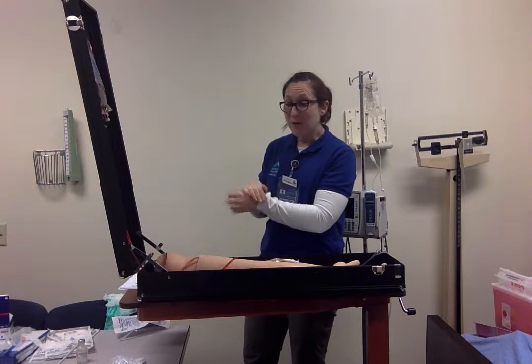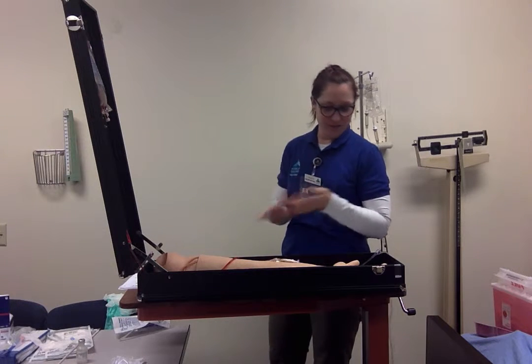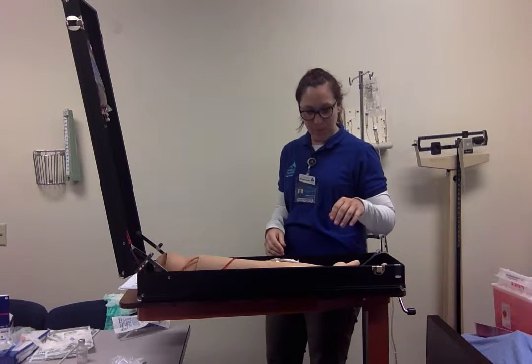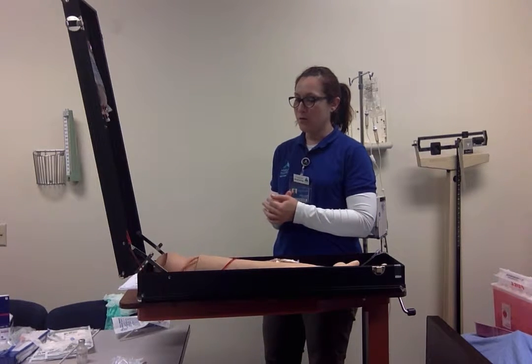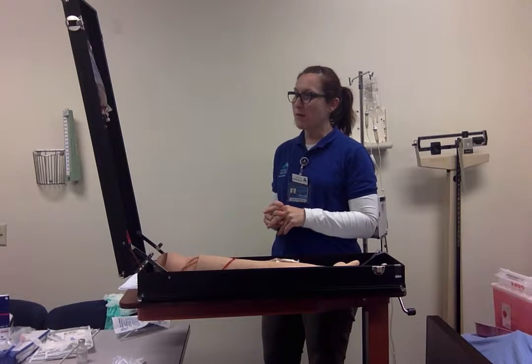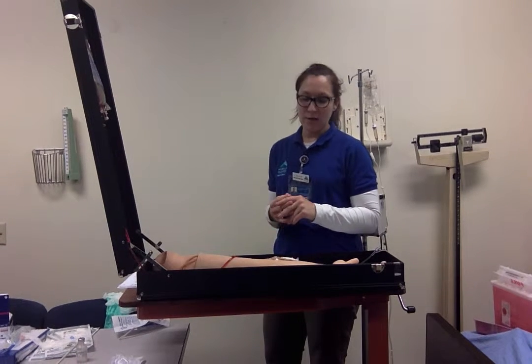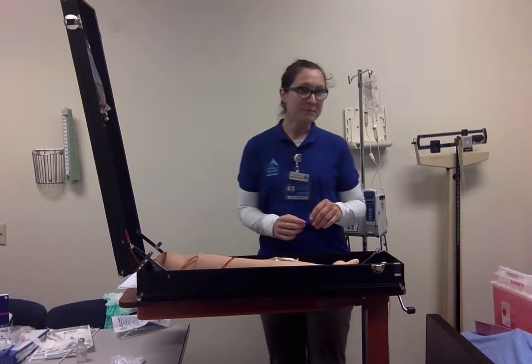Just going to wash my hands while I'm talking to the patient. And hello, Mrs. Smith, how are you today? Okay, just setting up your piggyback for you for the other medication that the doctor ordered for you, which is Rocephin, for your infection. Did you have any questions about that? No? Did you have any allergies? Okay, very good. Well, we'll get you set up.